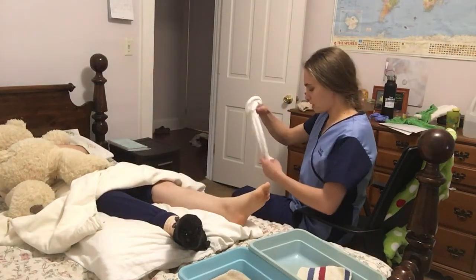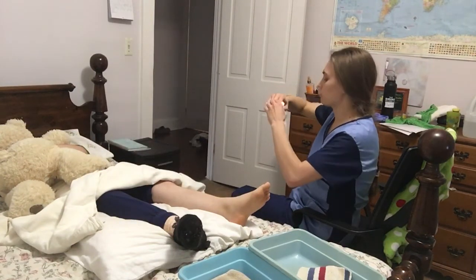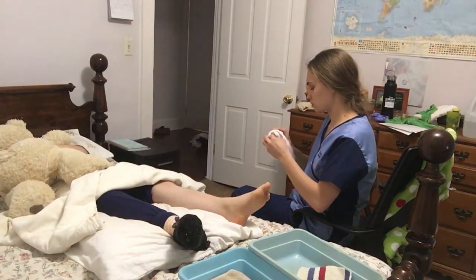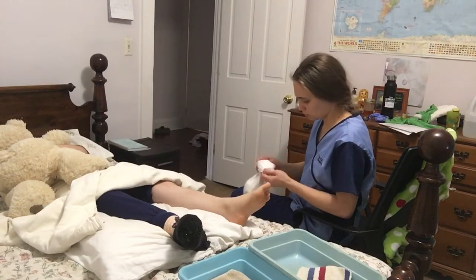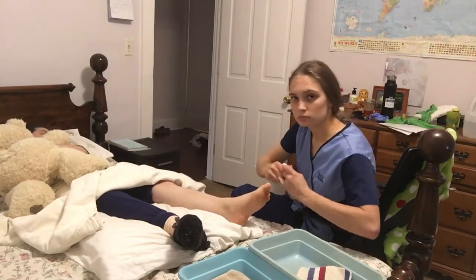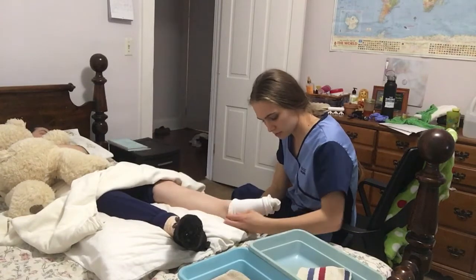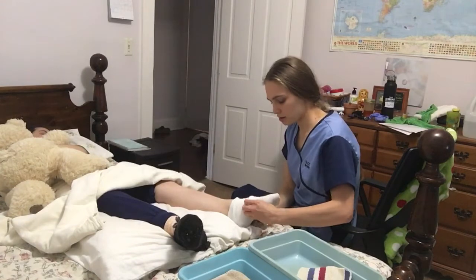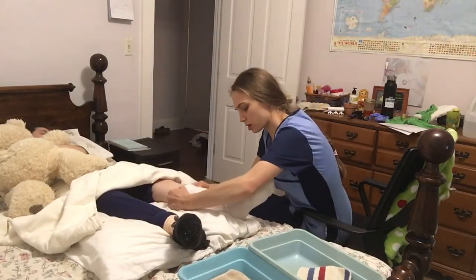So I would get my sock, find the heel, and fold it inside out. Then I would carefully place the heel part up to the patient's heel, and fold the other part up next, being careful to make sure there are no wrinkles.